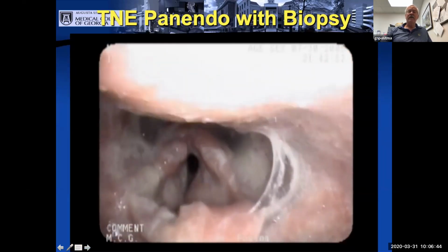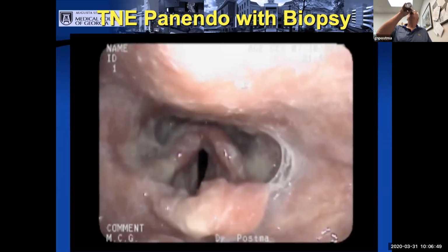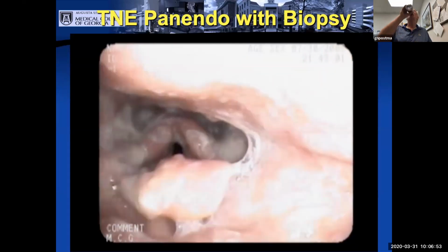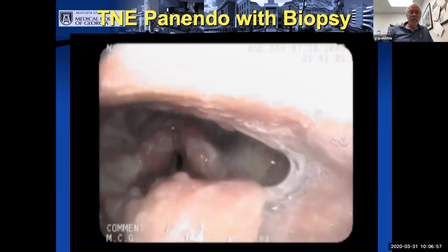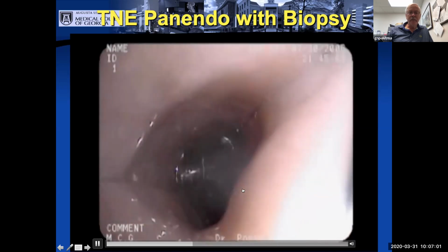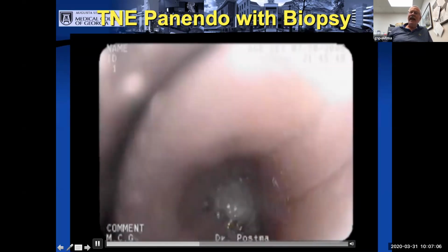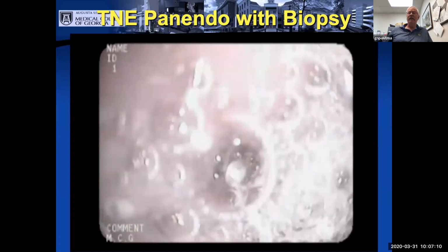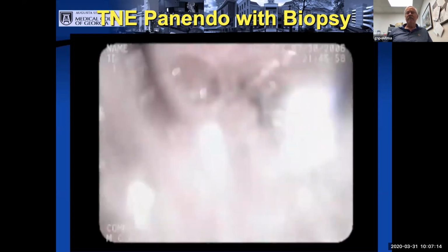obvious supraglottic tumor. A resident did this entire thing. Maybe I'll advance it just a little bit here. See the important stuff here. There we go. Pooling in the esophagus. Pooling anywhere has to be explained. I don't care if it's the piriforms, you got to explain it. The vallecula, you got to explain it. The esophagus, same way. You have to explain pooling.